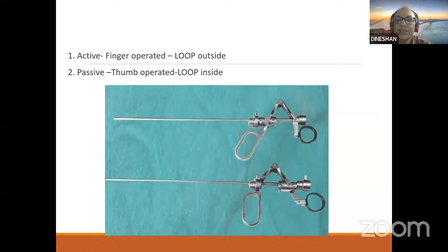And here you can see this is the double stem working element. You can see this is the area where the high frequency cord is attached. And the passive working element is, again, the same working element you all use with the internal urethrotomy system also.